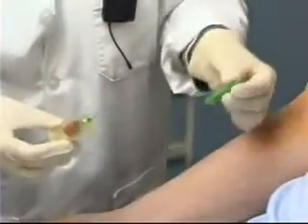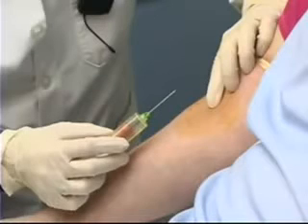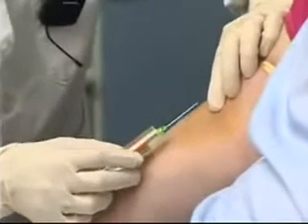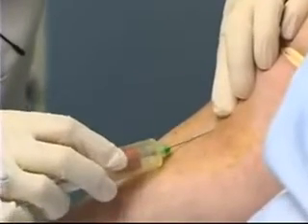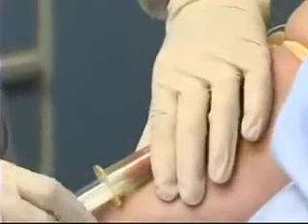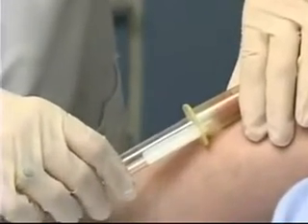I'm going to remove the protective cap from the needle, checking again that I'm going bevel up, and at a very small angle I'm going to insert the needle through the skin and into the vein. I'm now going to change the position of my left hand so that I'm steadying the vacutainer holder.